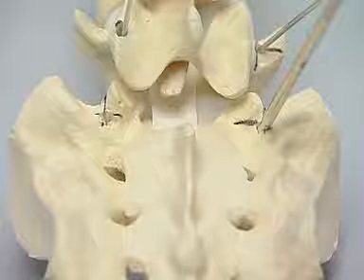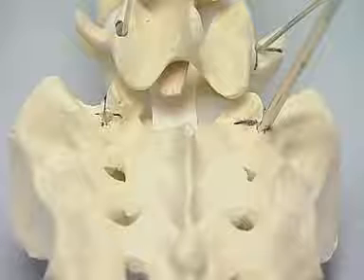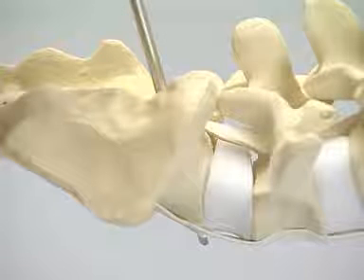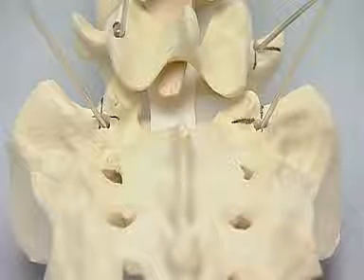The surface markings are drawn on the model using a marker, and the ideal exit points for the bicortical screws are shown on this model. The pedicle screw track is prepared with the awl and probe. As much medial angulation as the pelvis allows should be used. This shows the ideal trajectory in the lateral view, which will be monitored with the image intensifier in the theater. K-wires are inserted bilaterally, and at this level medial angulation is symmetrical.